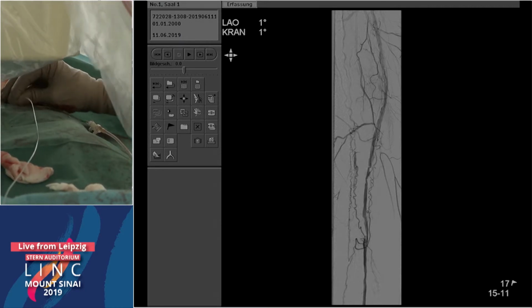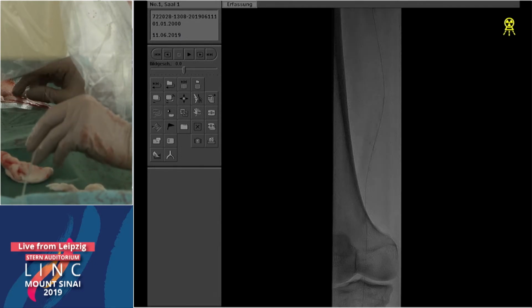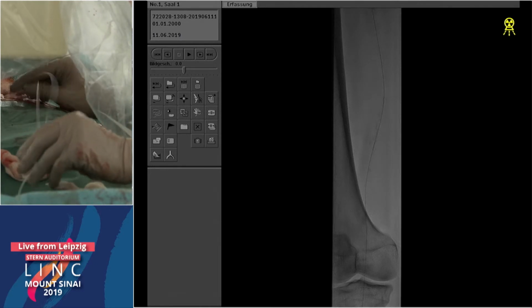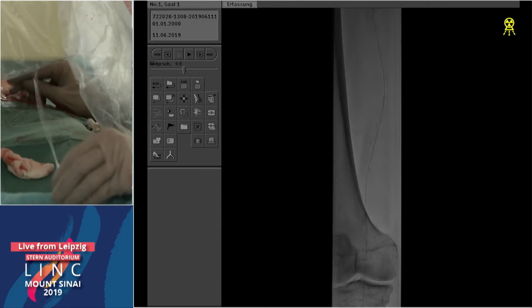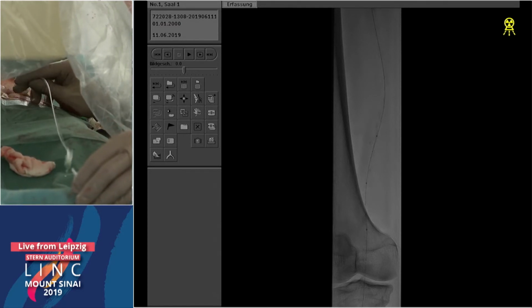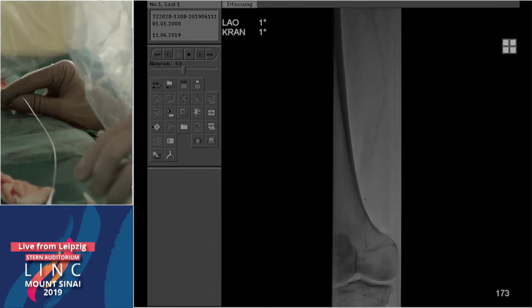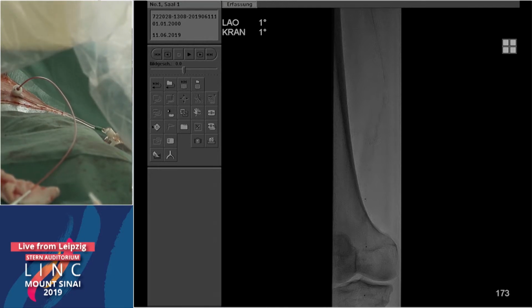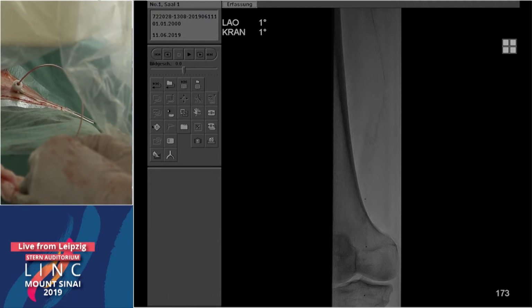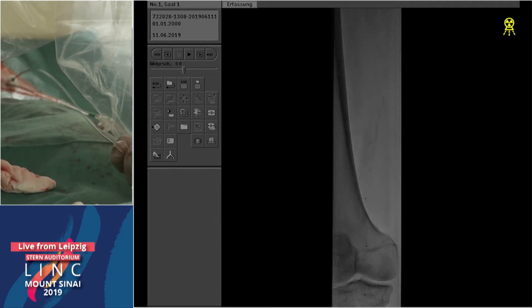Andre, how long was your balloon inflation? Do you think it's worth going back in and doing a prolonged inflation? I think it might be tough to fix that, but do you think that would work? I would say it was medium long, maybe not 2 minutes. I think we spent nearly 3 maybe. Seeing this, I don't think we'll have better results with prolonged inflation, maybe short focal, higher force ballooning.